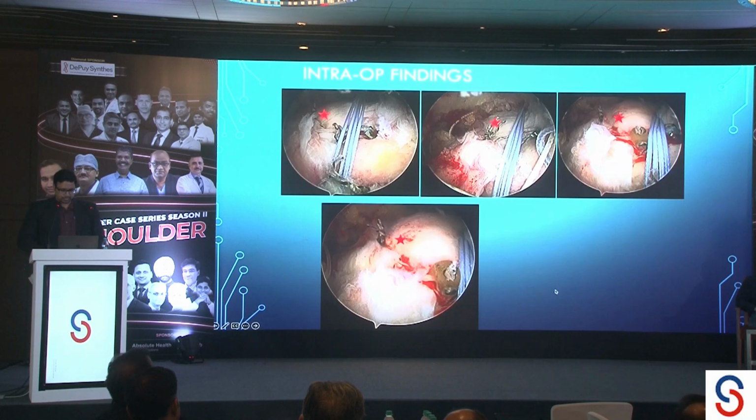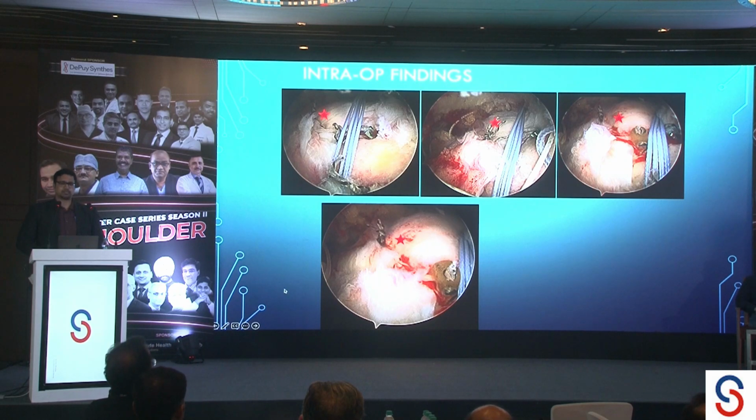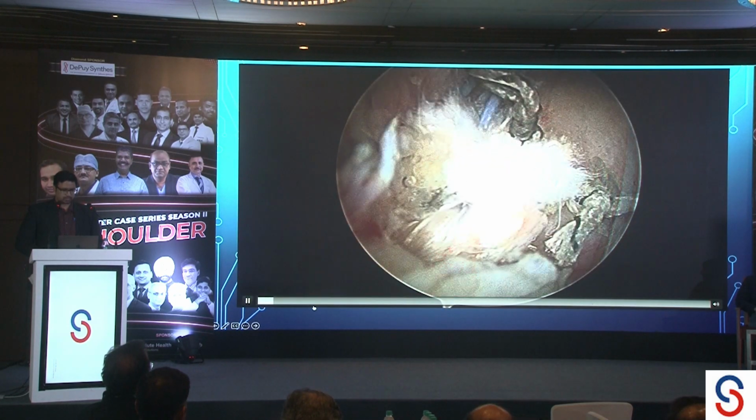For the posterior anchors, I had repaired the supraspinatus. I left one suture in both the anchors, because they were double loaded anchors, to repair down the latissimus dorsi tendon after it has been pulled into the final position. So this was the final repair.